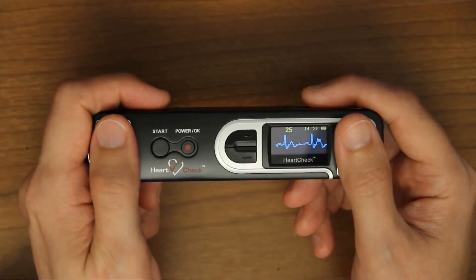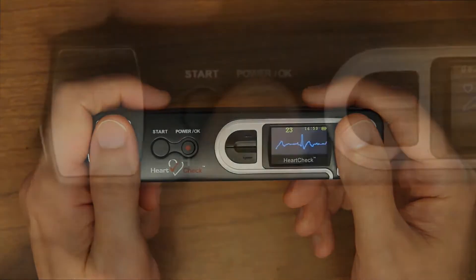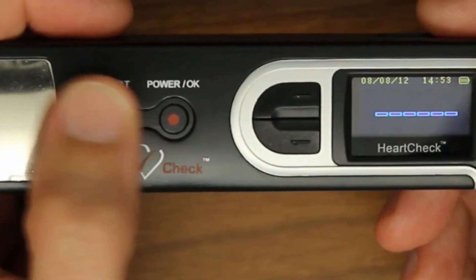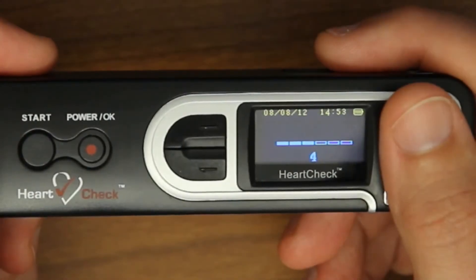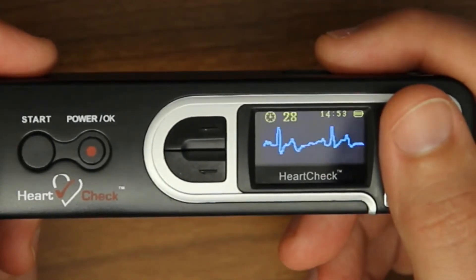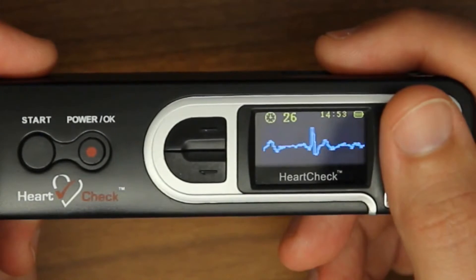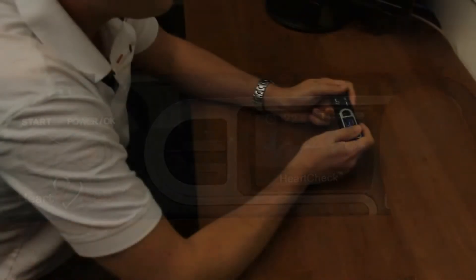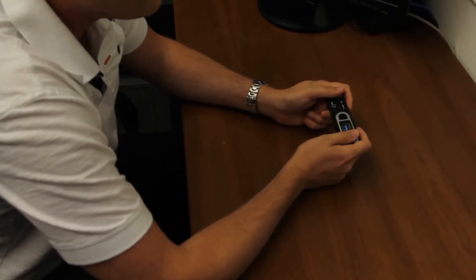While the device is on, you can take a measurement at any time by pressing the start button located on the front of the device. Press the start button to enter the preparation stage. After the six second preparation stage is complete, the device will begin the ECG reading. During this period, try to remain still and do not flex or move your fingers or arms until the reading is complete.